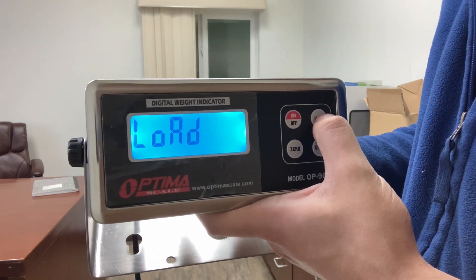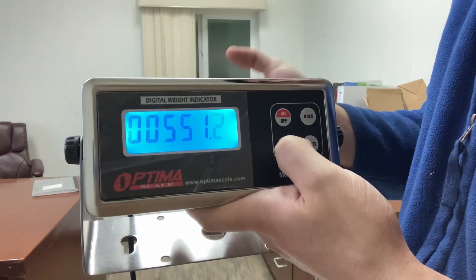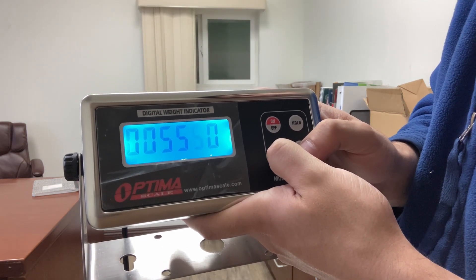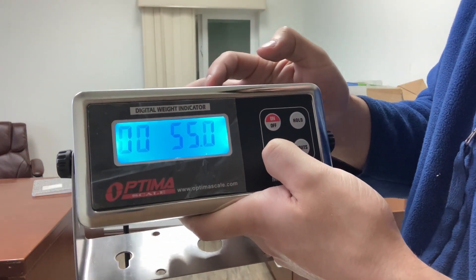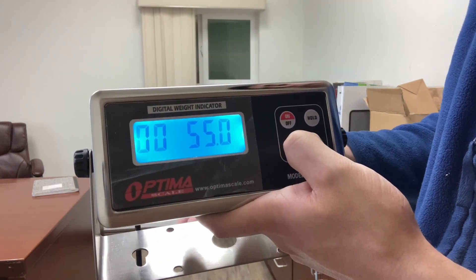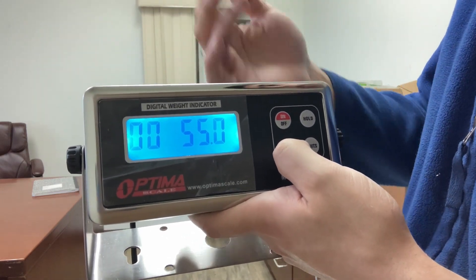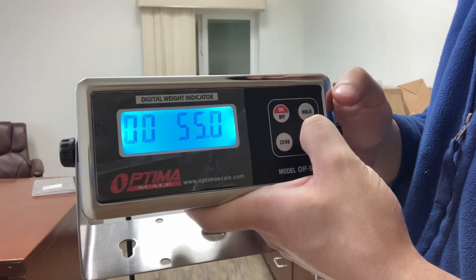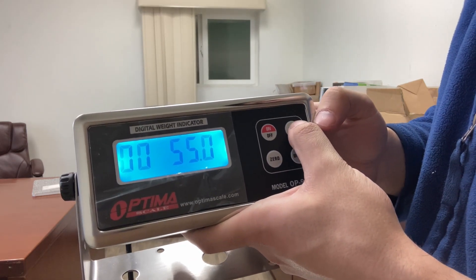Now you'll see load — this is where you enter the weight you're going to use to calibrate. Right now this is 551.2 pounds. I will use my body weight of 155 pounds, so I'll set it to 155.0 pounds. Make sure everything is clear on the scale. It's just telling the indicator I'm going to be placing 155 pounds. If you're going to put 100 pounds, move left and make it 100.0. Put whatever weight you're going to be using for calibration — in my case it's my own body weight. Now press the units button, then press the hold button.